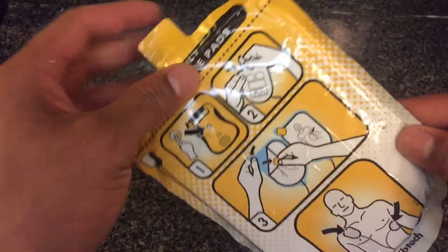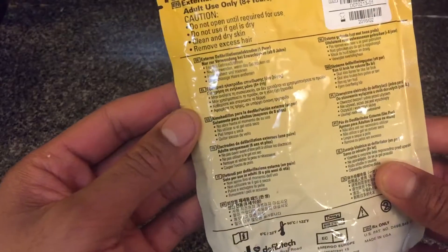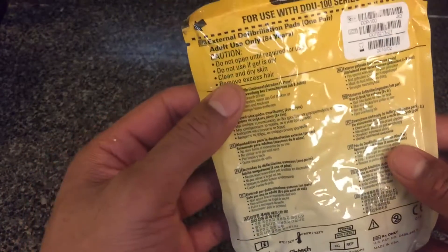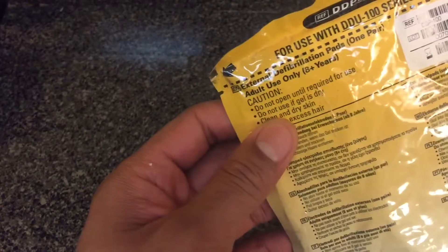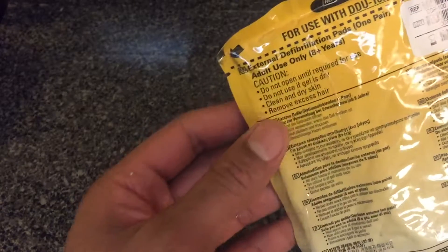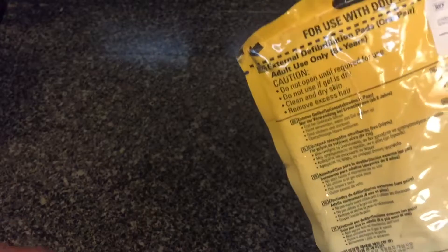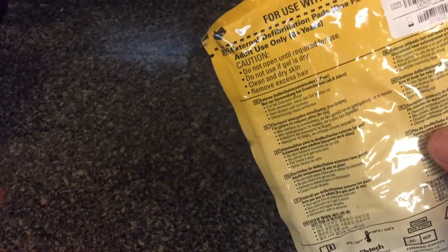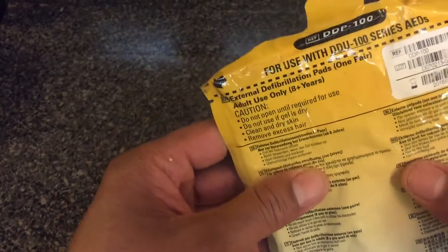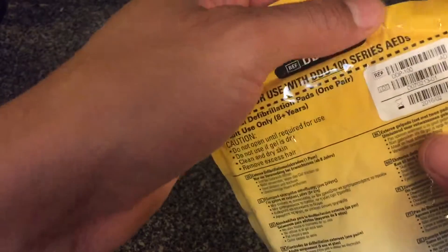If you look on the back, it gives you instructions about the pad. It says caution: do not open until required for use, because there's a gel inside. If you open it up, it actually dries up over time, so you want to keep this closed and airtight. You don't want it to be damaged because it will dry up the gel and may make it ineffective in saving someone's life.